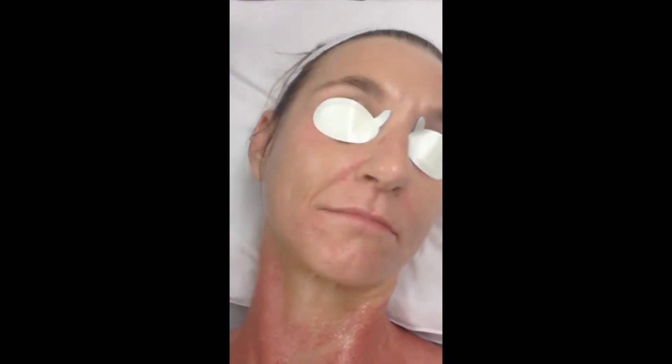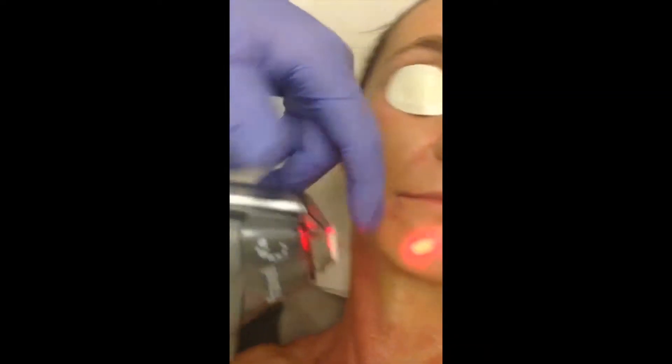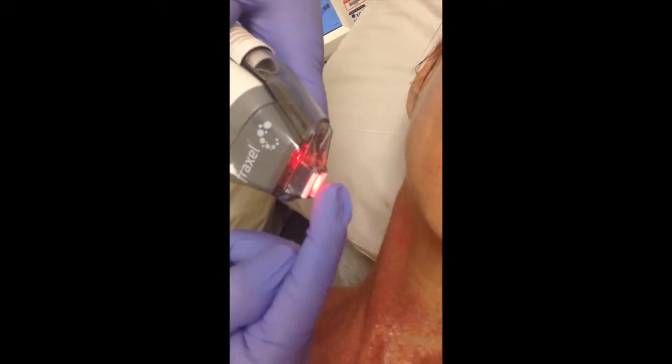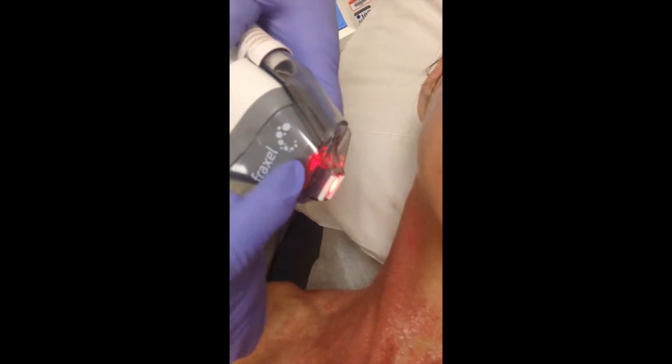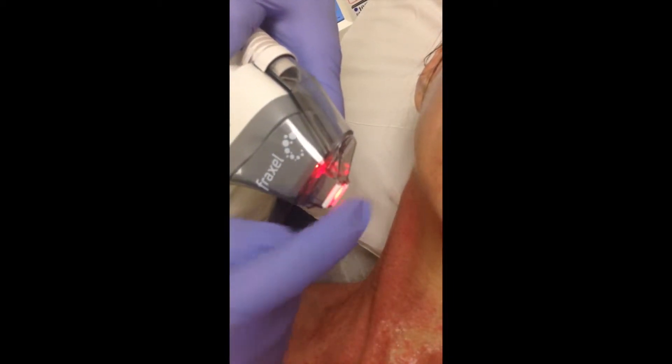I'm going to put some cold air on here — it's going to blow out of the tip. The treatment is absolutely at this tip right here, and that's exactly where the cold air is going to cool down the skin. So it's very efficient.